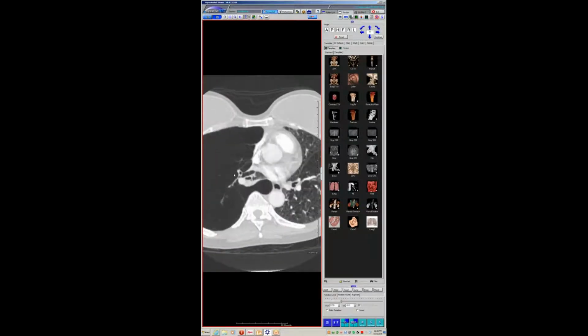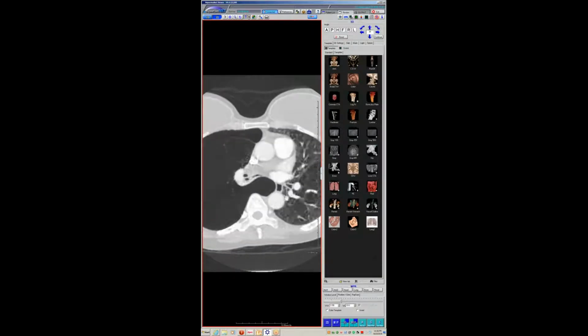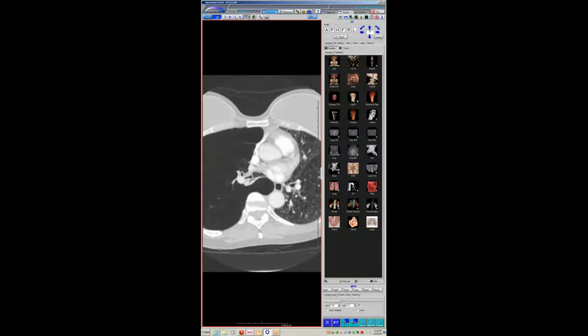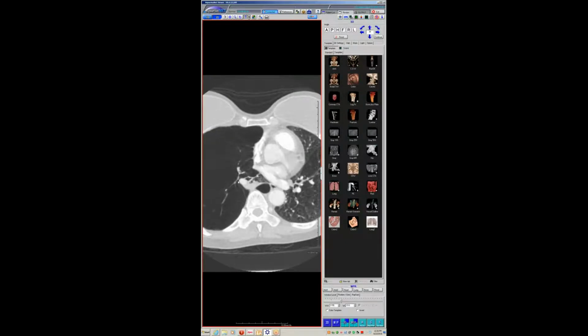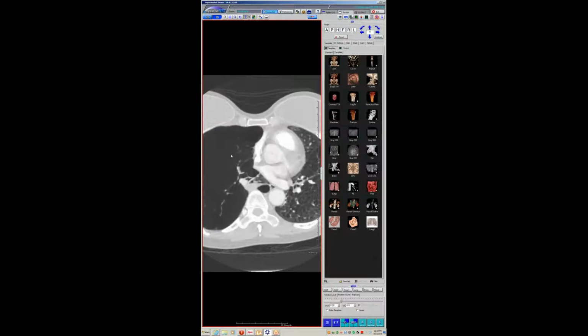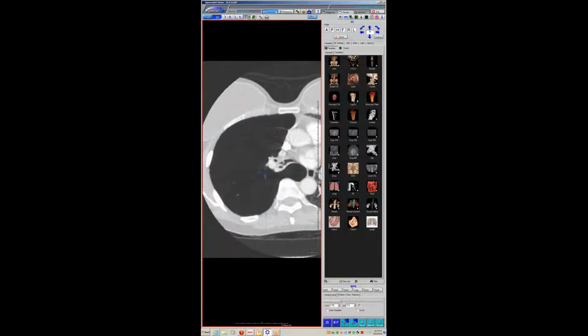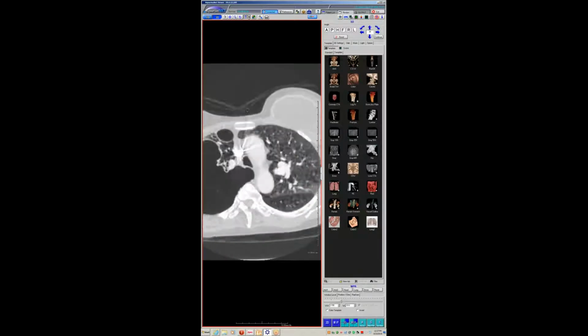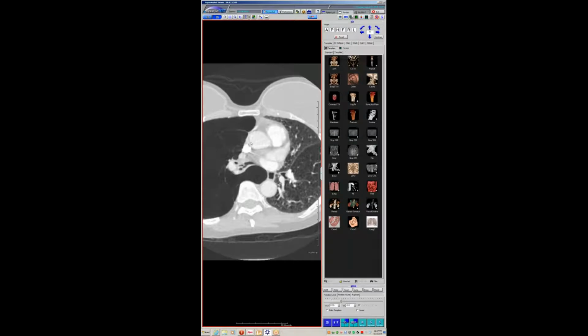I didn't know. And you can see the airways plug up immediately. The medial and segmental bronchi just almost go away. You can't even see them, and you don't see any airways distally, presumably from the emphysema. I was confused. So she seems like someone that might benefit from an endobronchial valve. Is that what they're thinking about for that right middle lobe?